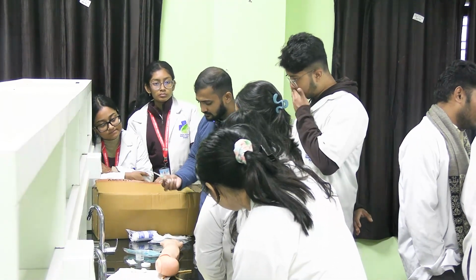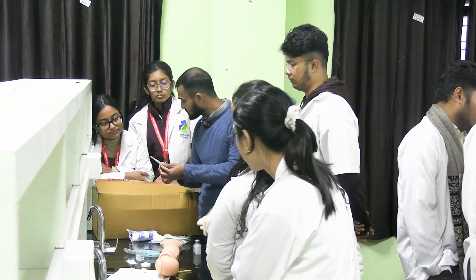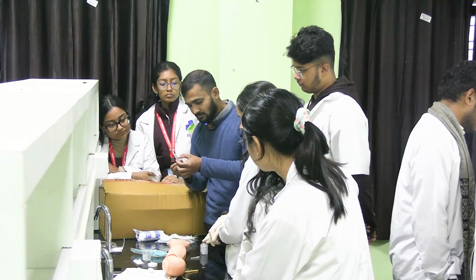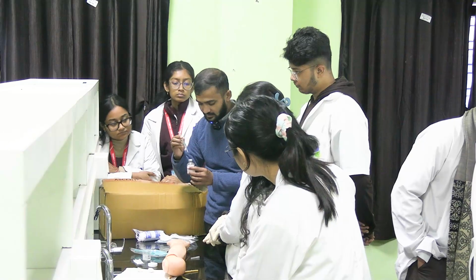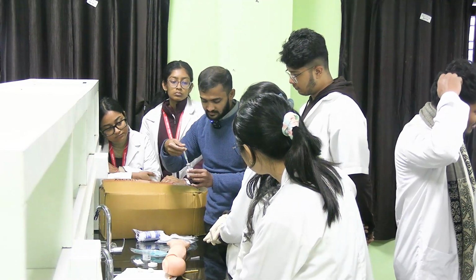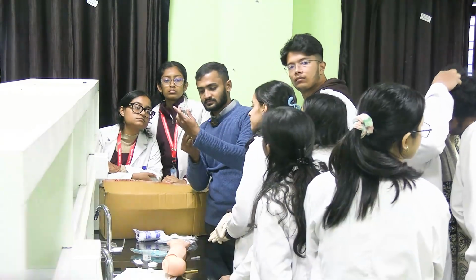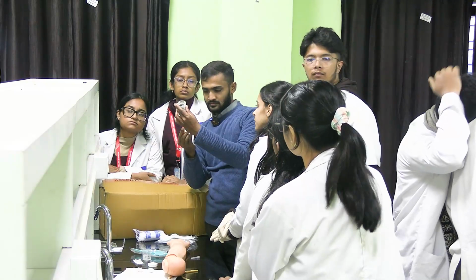First of all, you have to check the syringe whether it is properly working or not. The plunger might be defective sometimes. Check whether there is air or anything trapped inside it. Okay, all is working. Suppose you will be taking 1 ml, exactly draw 1 ml of air. Go directly in after disinfecting the area. Introduce the air there. Make the vial upside down and then take the drug. Take a bit more. Okay, I am taking 1.1. Fine.